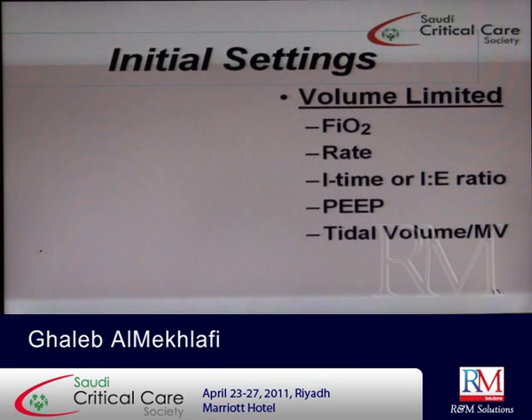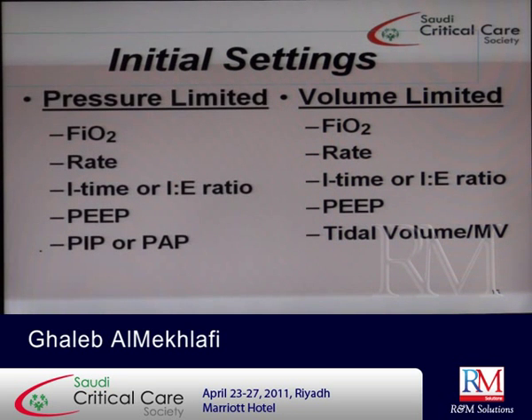Now, the initial setting in volume limited or volume cycling modes, we set these parameters: FiO2, rate. These are the common parameters, and there are additional parameters according to the mode you are choosing, and for more security: the inspiratory time, inspiratory-expiratory ratio, PEEP, and tidal volume. In pressure modes, again the same parameters, but here this is the only difference. In volume modes, the parameters are the same for all ventilators, but you are concerned here about the tidal volume that should be preset by you.